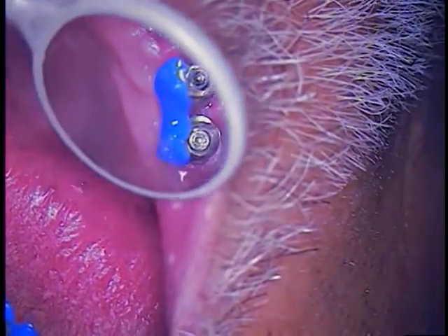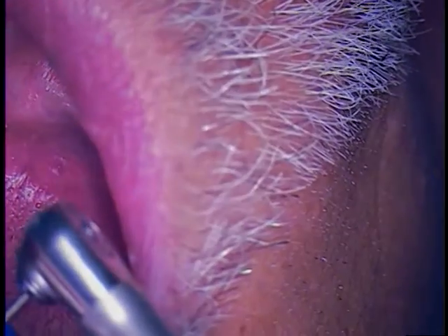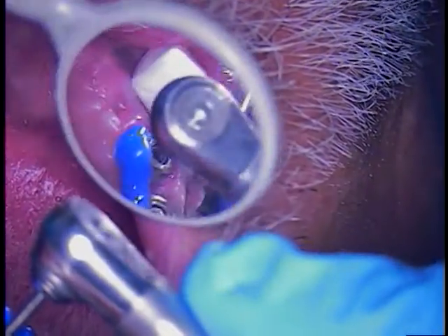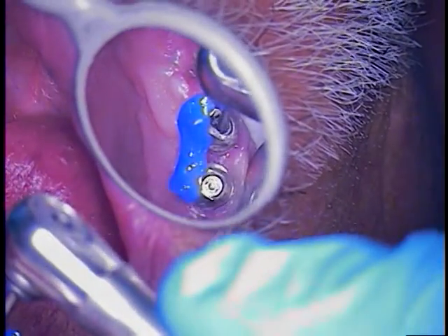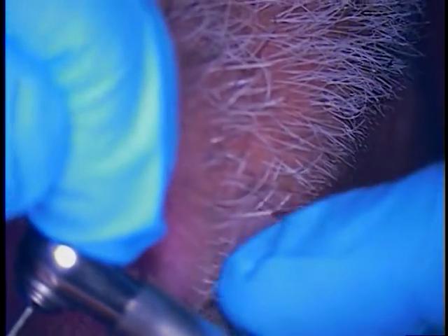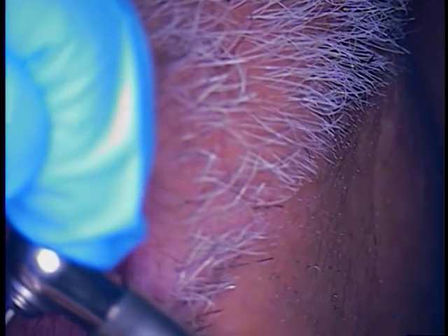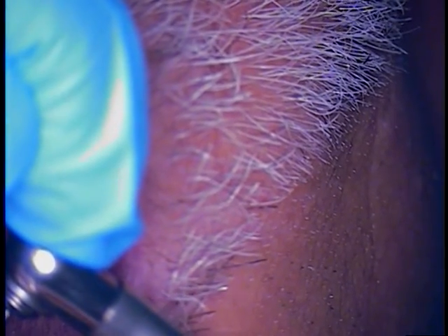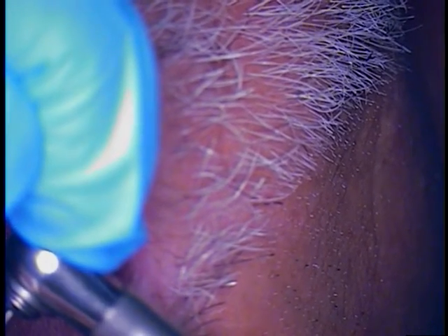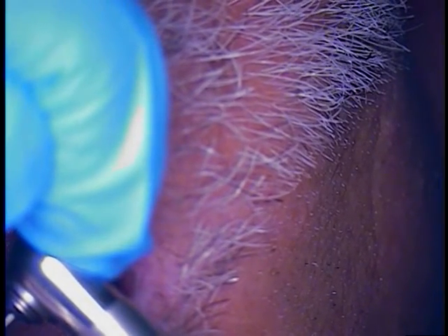So here it goes. Lining it up. Now get a good seat. That's the key — to be dead on, spot on, with your driver. I always wiggle it a little bit. I'm going to click it this way. Hear the click. Now apply low pressure.